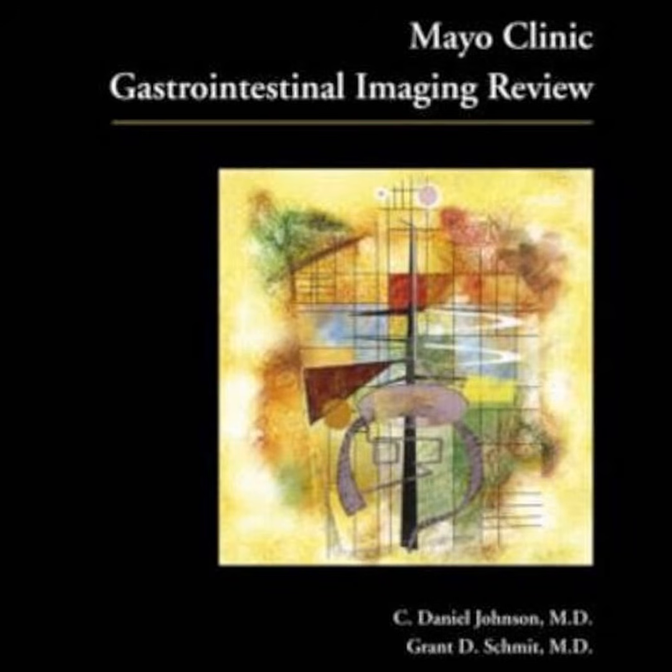Yeah. So following the digestive tract down from those infiltrative mimickers, we arrive at the massive inflammatory battlegrounds of the colon. The lower GI tract is a whole different beast. It really is. The text contrasts two absolute heavyweights here: ulcerative colitis and Crohn's colitis. Let's start with the radiographic hallmarks of ulcerative colitis, or UC. Well, with UC, the colon loses its normal haustra, those normal segmented pouches. Right, becomes completely featureless. People often call it the lead pipe appearance. Exactly, a lead pipe. And the mucosa also has this diffuse granular appearance on imaging, which basically represents superficial mucosal ulceration. The immune system is essentially just stripping away the inner lining of the colon.